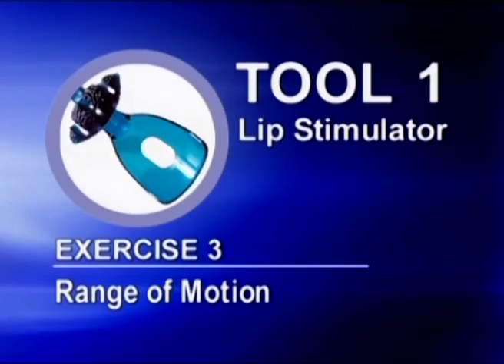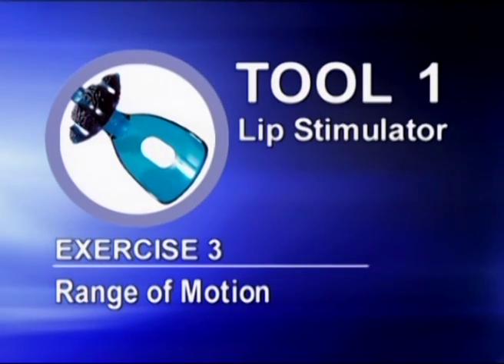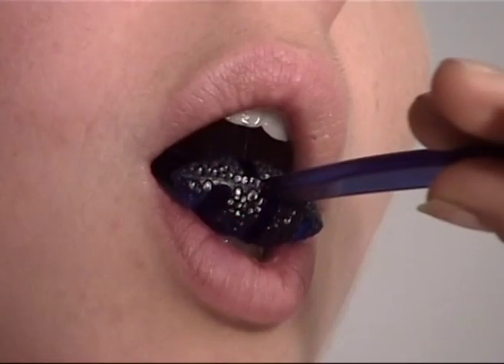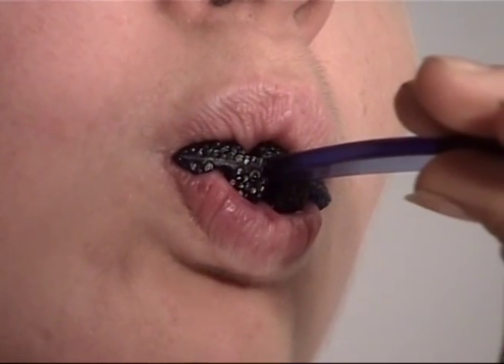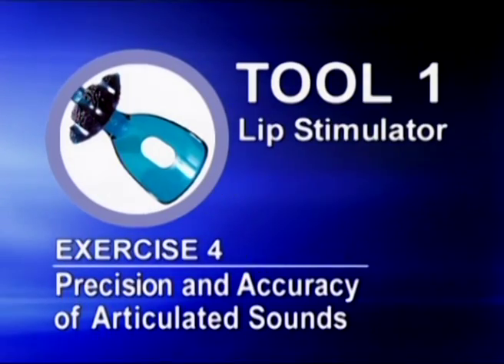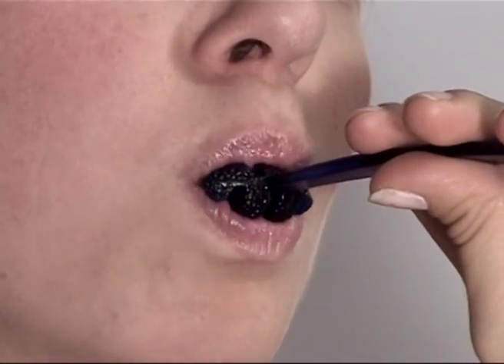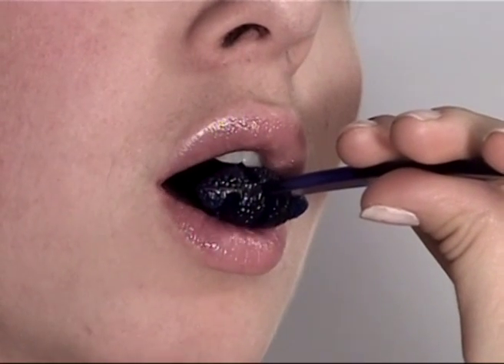The goal of exercise protocol 3 is to increase range and ease of movement. Place tool number 1 on the palate behind the front teeth. Open and close the lips around the football shape as many times as possible. Record number of closures until fatigue. The goal of exercise protocol 4 is precision of movement. Place tool number 1 on the palate behind the front teeth. Repeat the following sounds with the lips closing around the football shape every time a P sound is made.